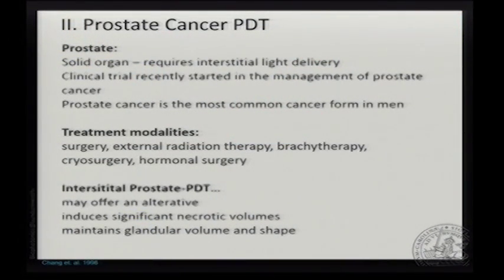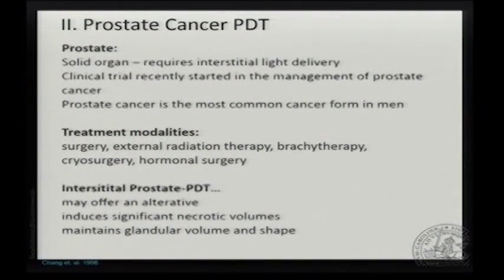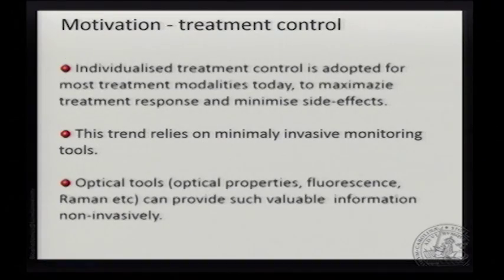So now let's get down to the second part of the talk. That would be prostate PDT. Prostate is a solid organ. Men have a lot of cancers in the prostate, so it's a very common type of cancer. We have a number of different techniques to treat that, but maybe there is room for another treatment modality, and that could be interstitial PDT. And this is what we are trying to look into, if we can do that.